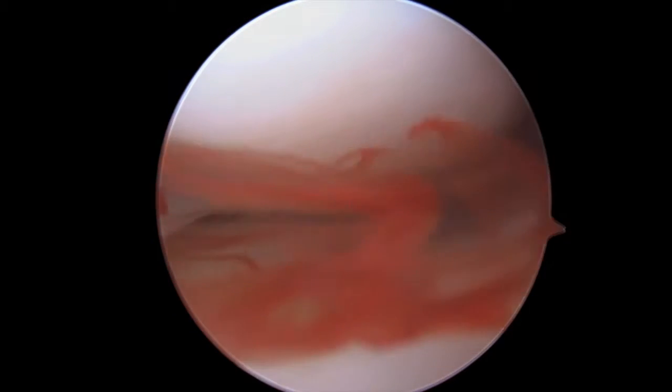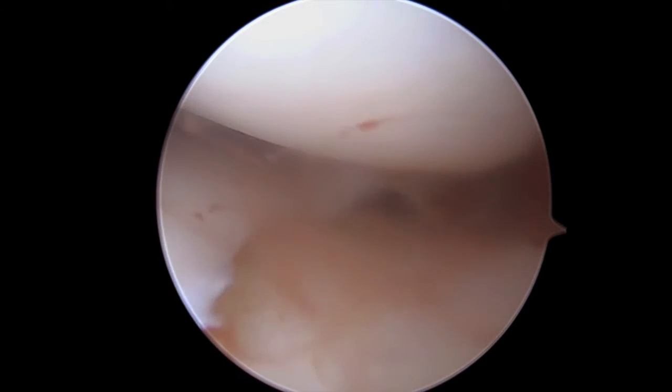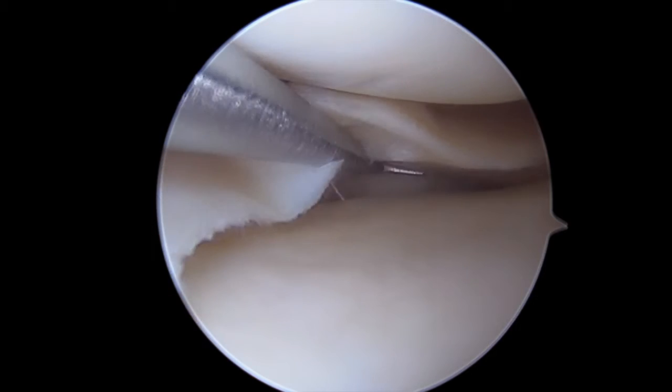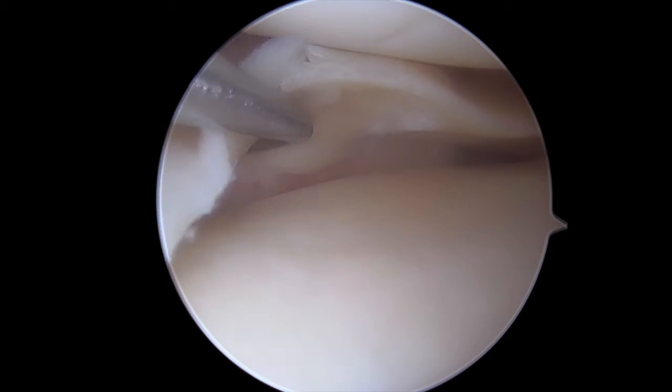Hi, this is Dr. Chris Deuter from Bentonville, Arkansas. Here we're demonstrating how important meniscal trephination is when repairing a radial split vertical complex tear of the medial meniscus. We really don't have access to get to this meniscus without trephinating the medial collateral ligament, so I've trephinated the medial collateral ligament to give us access, and now we can see this complex tear.